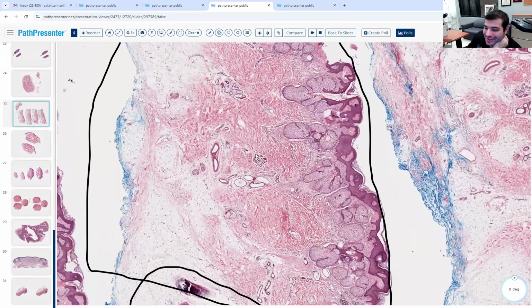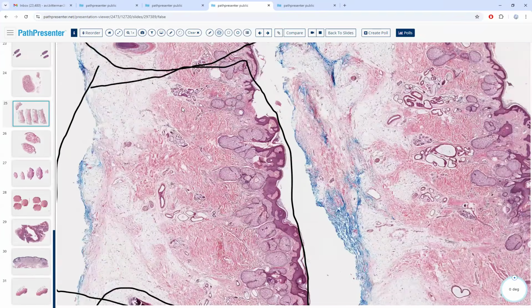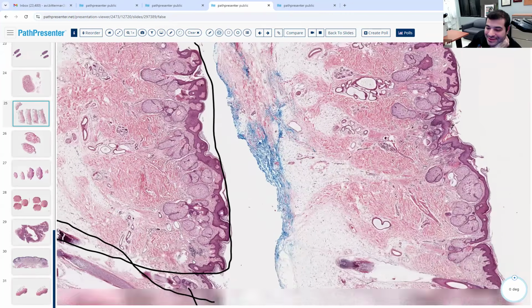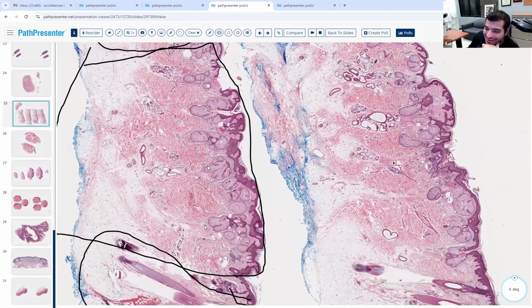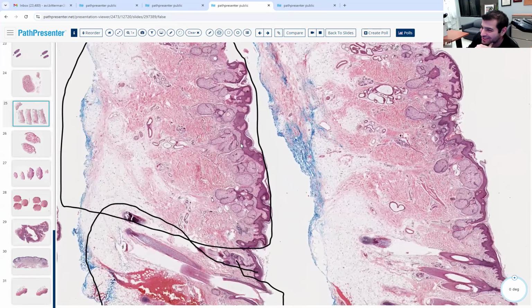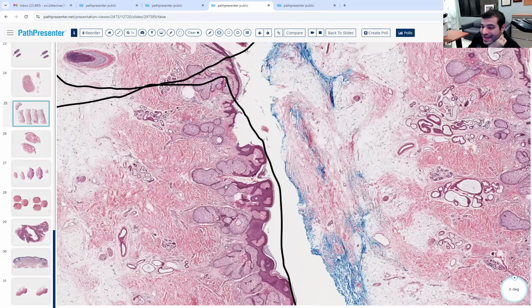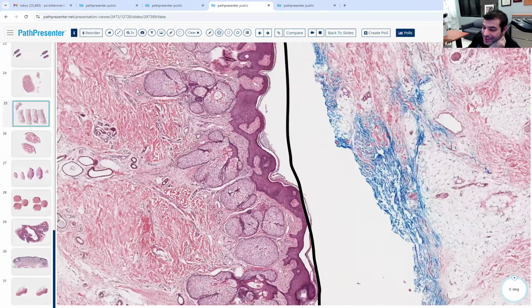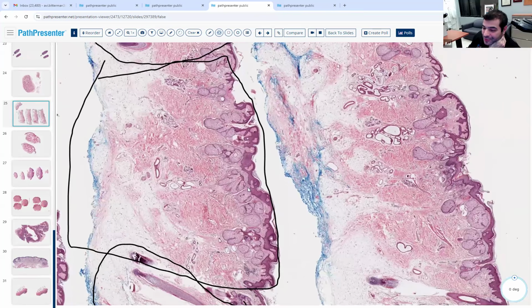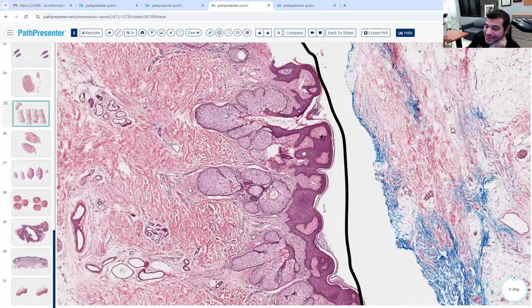Sometimes you might find apocrine glands here. And it's papillomatous. And it has sebaceous glands. So it's bold, it's broad, it's bumpy, and it's bubbly. Bold, broad, bumpy, and bubbly. Now, it's not as bumpy and it's not as bubbly prior to puberty, but it is more bubbly right at birth.